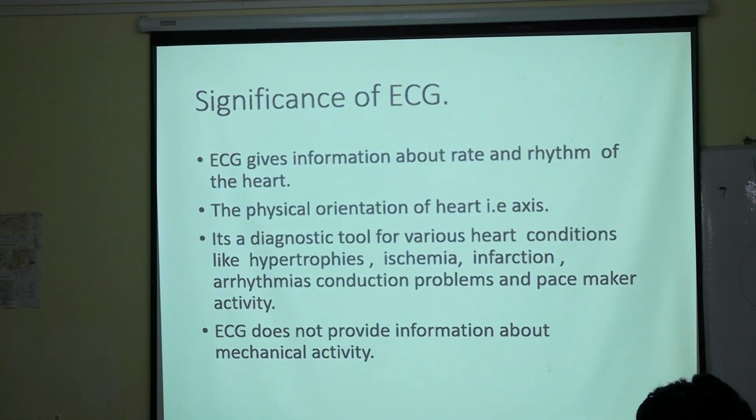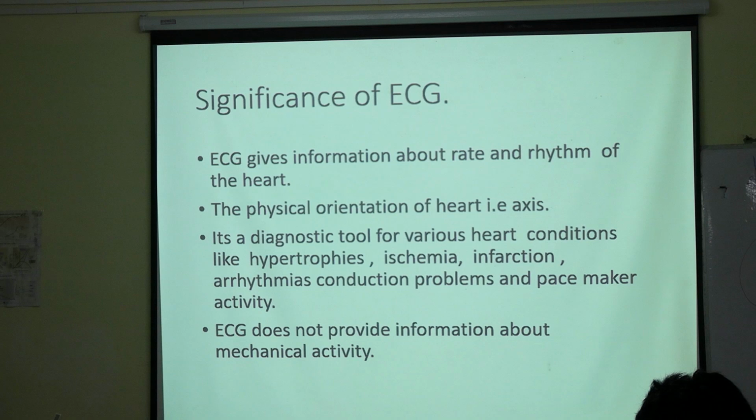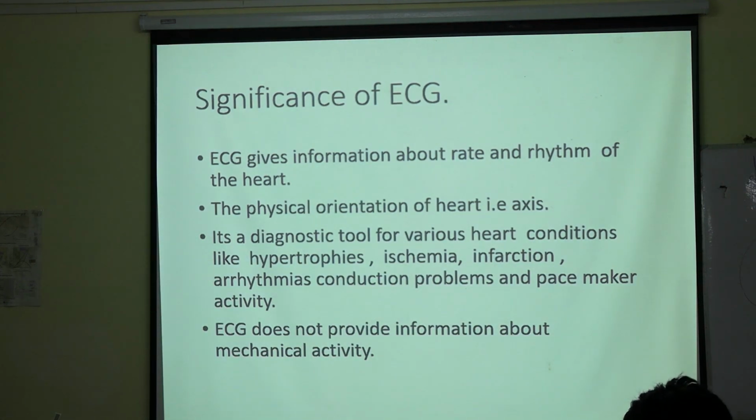What is the heart rate? And whether this heart rate is rhythmic, that is, it is happening after a fixed interval. With that we can determine whether the heart rate is rhythmic.